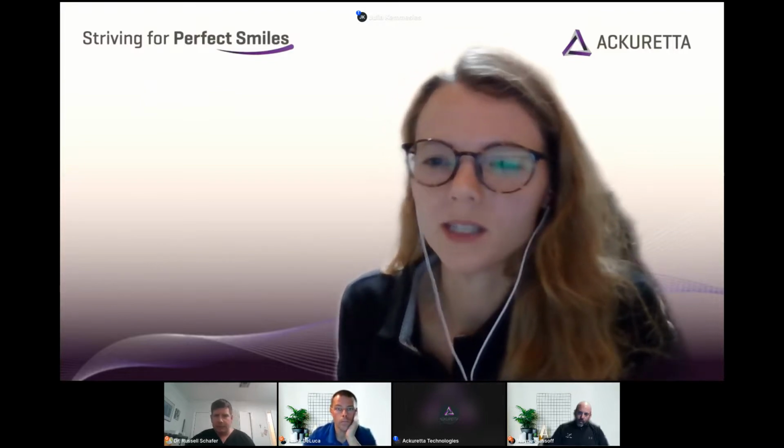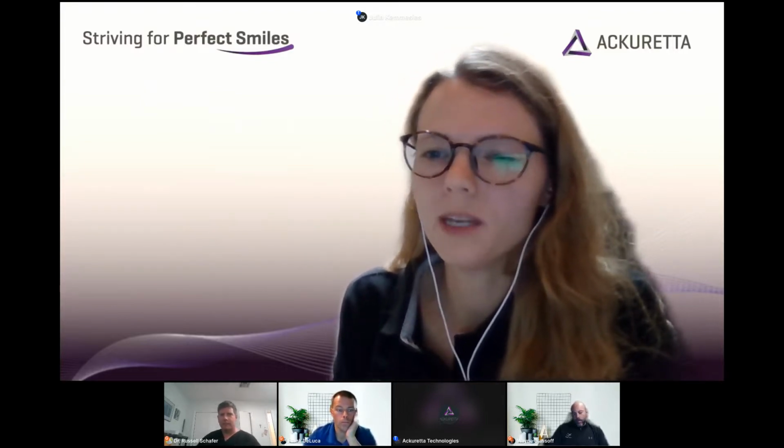For denture patients, is it recommended for immediate or for final? I think that question is for Dr. Schafer. Yeah, I can definitely answer that. So I would say when you're starting out with this whole process, make it only for immediate dentures, because it's just so much more forgiving. No one's ever been sued or had a board complaint over a poorly fitting immediate denture, when you really get to learn how it works. So I love it for immediates.